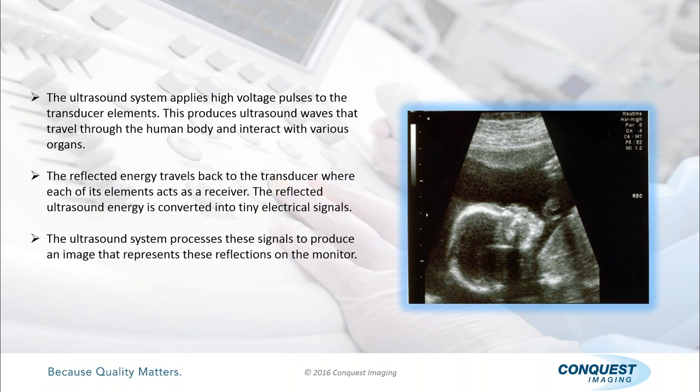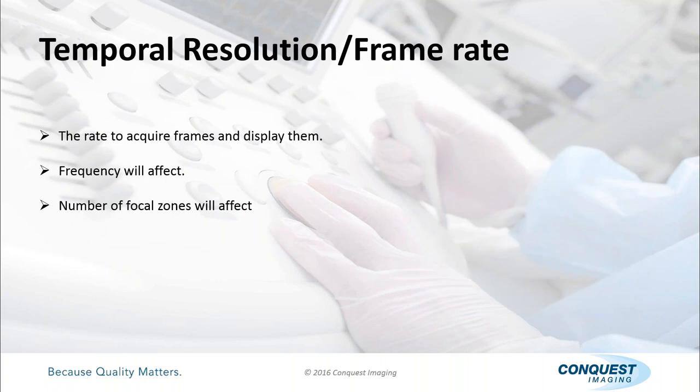So different ways to display this. You can also see that in one case, the baby's hand, which appears to be top right of the image, produces a shadow below it because it's a very dense object, and you do get some shadowing right below it. So that's an example of what I'm referring to.